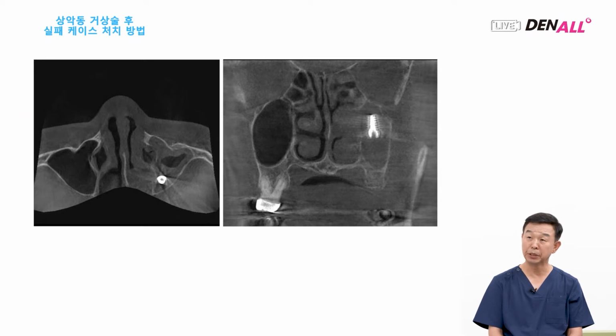On the CT, it is not exact, but the granulation tissue is surrounding the fixture, right? Yes, it is buried in the soft tissue. It will be challenging to remove it.